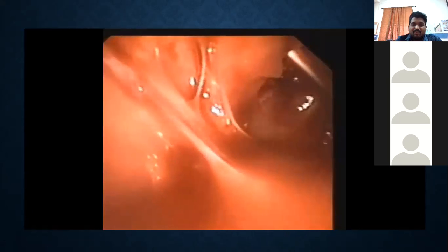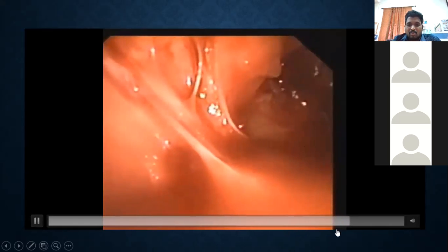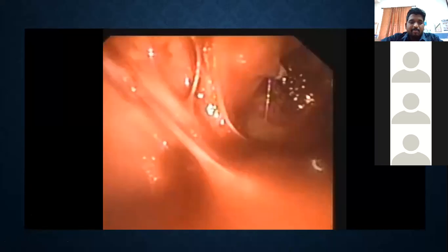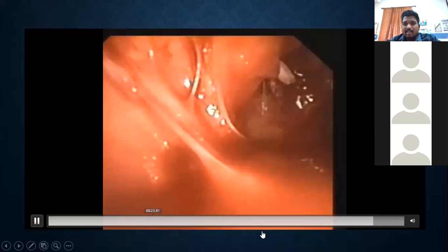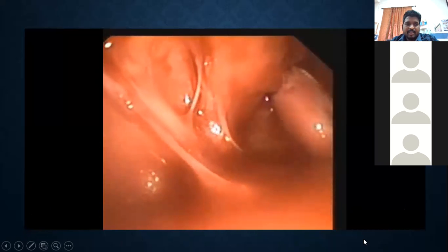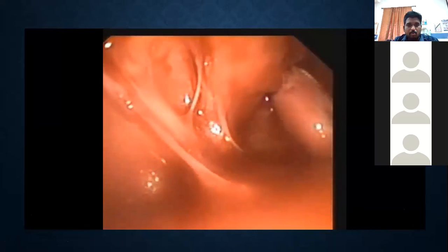It's very difficult. So what we literally did is that we put multiple ports along with the thoracic surgeon. So we put a hand inside. Now you could see, I'll just pass it. You could see the wire here. You see that? It was a very thin wire. It was very sharp at the tip. And literally we palpated, and through finger only we could recover that. Finally, without major surgery, the foreign body was removed successfully. This is one of the largest interpleural foreign bodies removed till date.